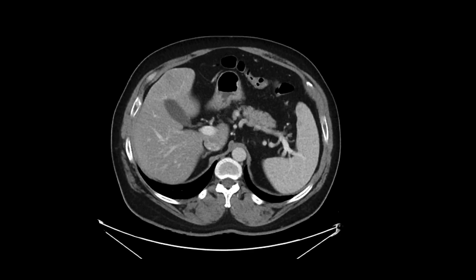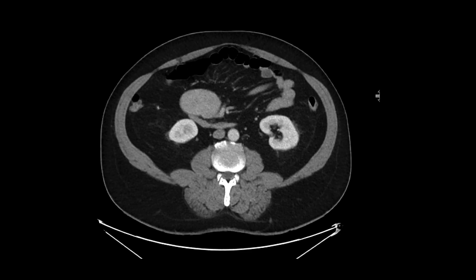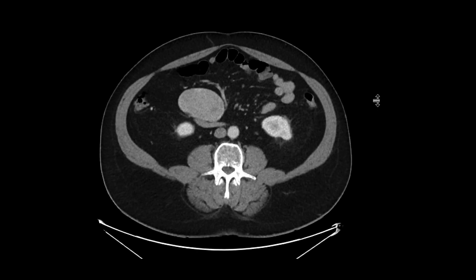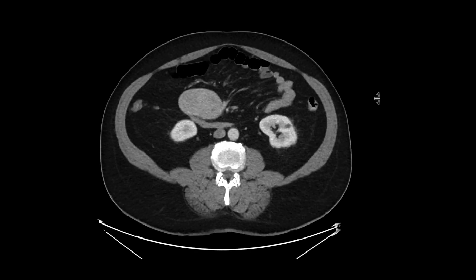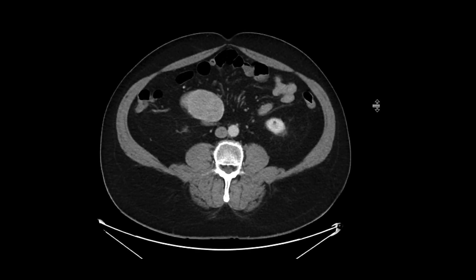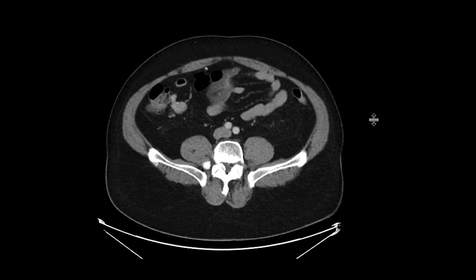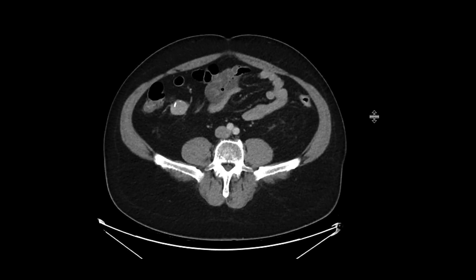Let's have a look elsewhere in the abdomen and pelvis. We can see more inferiorly within the mesentery there's this large, lobulated mass, very heterogeneous, within the mesentery of the right lower quadrant. Even lower to that, there's a smaller mass, and with this mass we can see that there are a few flecks of calcium at the periphery of it.